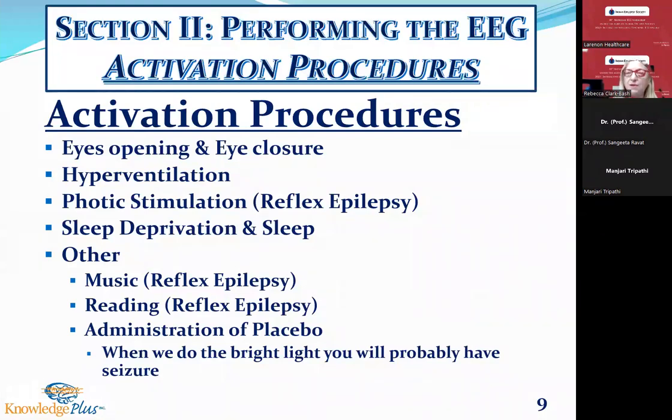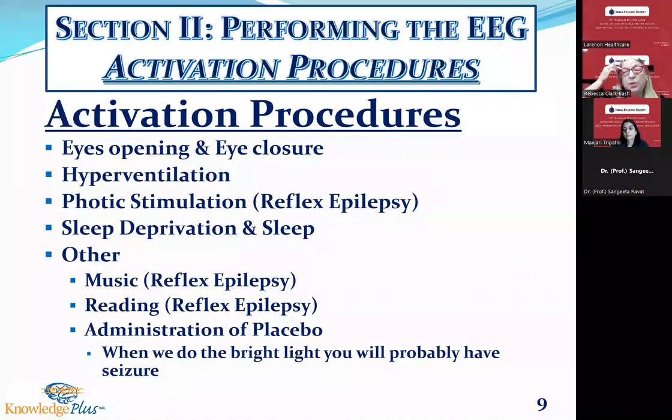Now, as soon as photic is done, I used to wait till the end of the recording, but then they are sleepy or sleeping. And if they're nodding off during photic, it's not going to have any value. So again, they're wide awake. I do their photic stimulation. And then when that's done, I'll start my hyperventilation. And again, I'll talk about the parameters of that in just a bit.